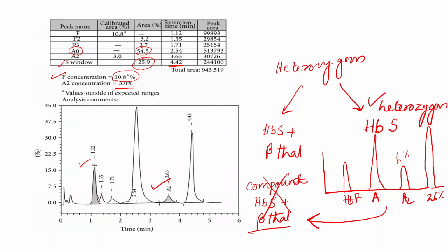a family screening or a parental screening, because for a person to have a compound heterozygosity, one abnormality should come from one parent and another abnormality should come from the other parent. So if one parent, like father or mother, is having a normal HPLC and the other person is having HbS, then it can also be a simple heterozygous HbS, because some adducts or acetylated products of HbA can also coelute at the A2, giving a false rise of HbA2. This false rise can reach up to 4-5%, but not more than that.